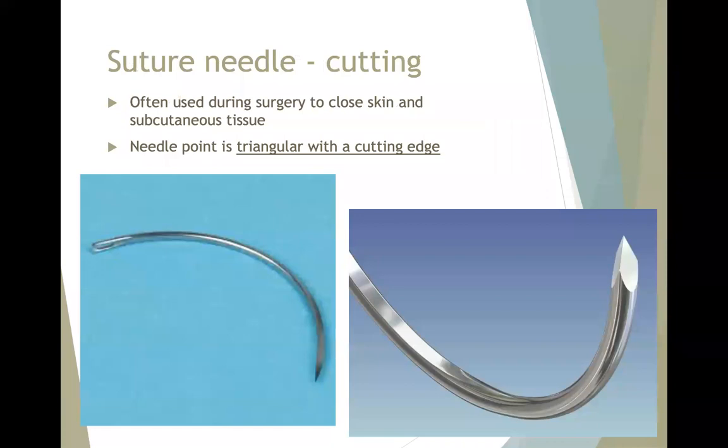Getting into our suture needles, we have our cutting needles, and kind of reviewing from last time, we know our cutting needles, they have that sharp tip to them, and they'll actually have kind of like a triangular shape that will inflict that cutting action. Now, some of them are more blunt, or they have reverse cutting. And you guys can refer to the images on the chapter 9 lecture to review on that. You can also see in your flip book, they have a lot of different kinds of sutures in there and the different types of needles.